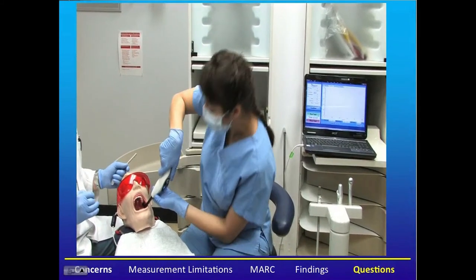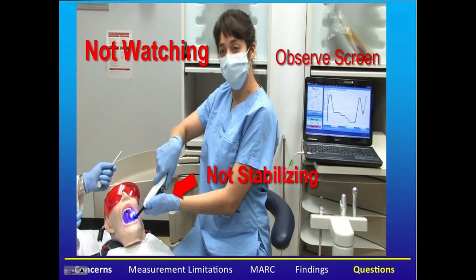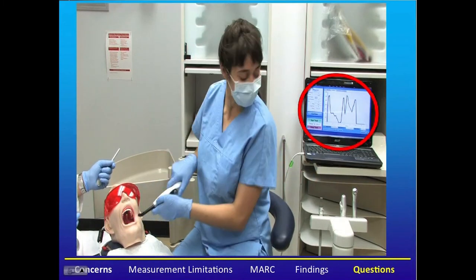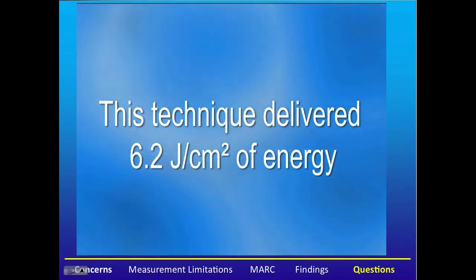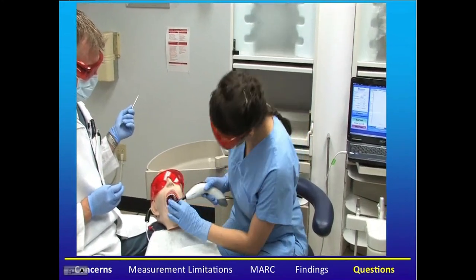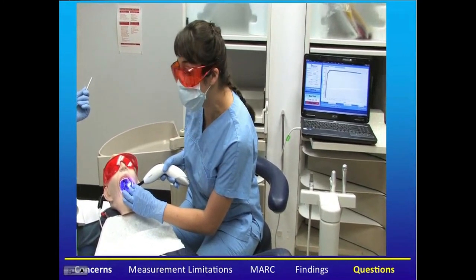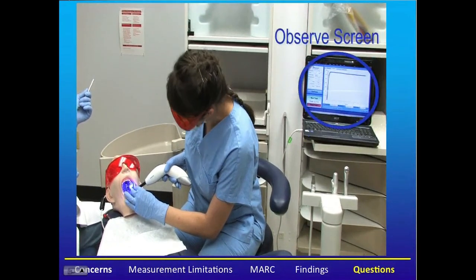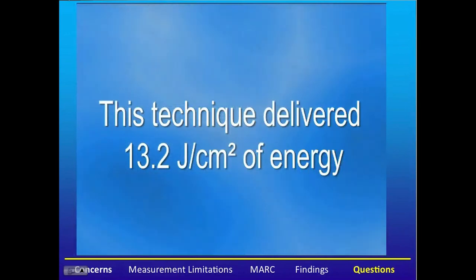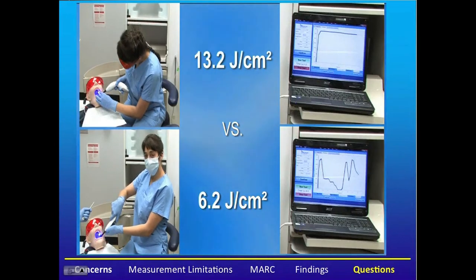We're now going to look at a video showing MARC in action. The assistant is curing the restoration but not watching what she's doing and not stabilizing the light guide. You can see on the screen how the irradiance goes up and down as she moves on and off the tooth — this technique delivered 6.2 joules of energy. Now we see her paying attention, adjusting the light guide to maximize energy delivery, watching and stabilizing. The screen shows a very uniform, constant irradiance being delivered — almost perfect. This technique delivered 13.2 joules. By improving technique, we're doubling the amount of energy delivered.